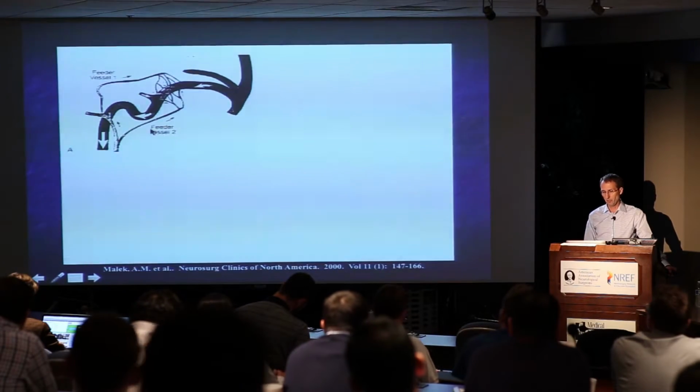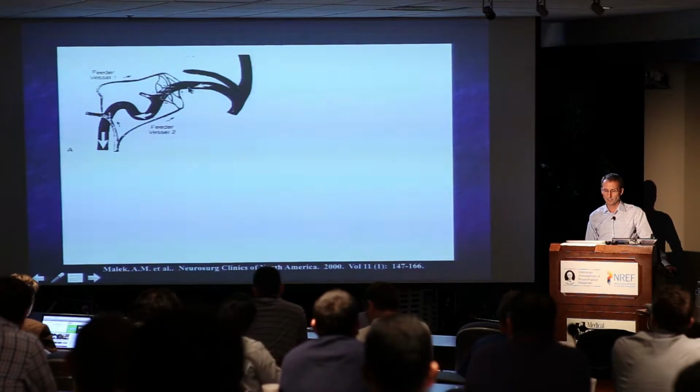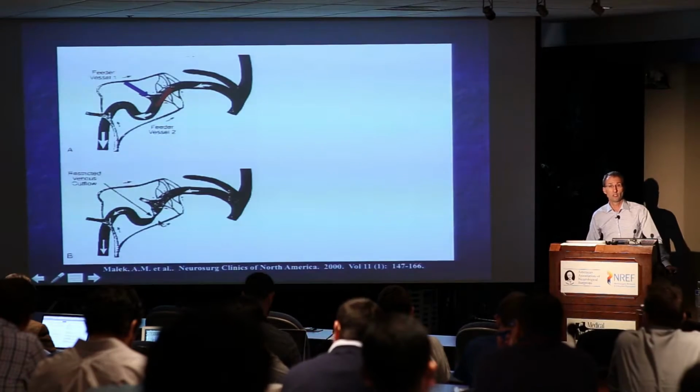But this is the same idea. Again, you can consider this being occipital feeders. This might be middle meningeal feeders coming to a dural fistula along the transverse sigmoid sinus. And again, in this case, all the arterialized outflow is antegrade down the jugular. This would be a low risk situation. Well, dural sinuses and venous structures aren't really geared to deal with high pressure and high flow. And one of the consequences over time is often referred to as a high flow venopathy, where you can get progressive stenosis of the dural sinus, so just distal to the arterialized segment.